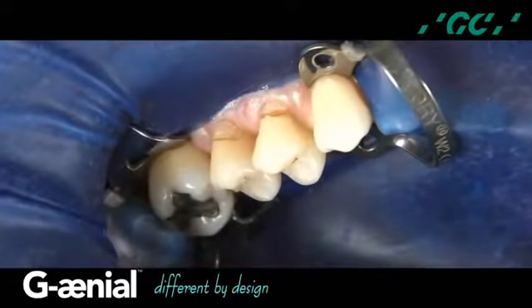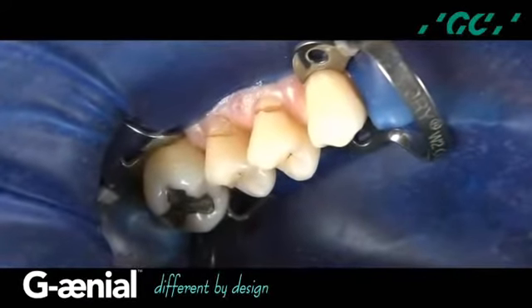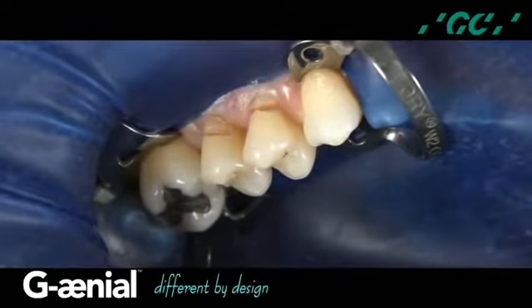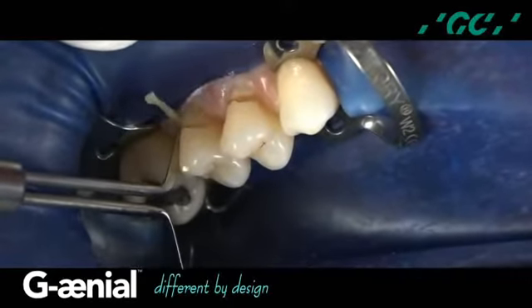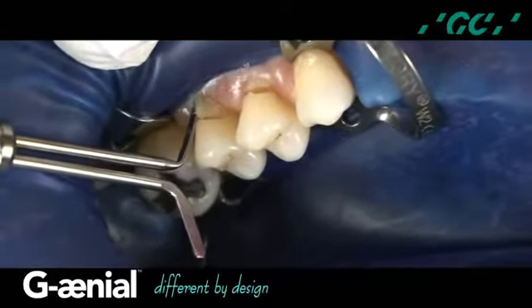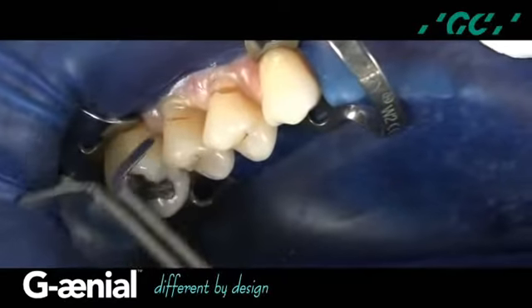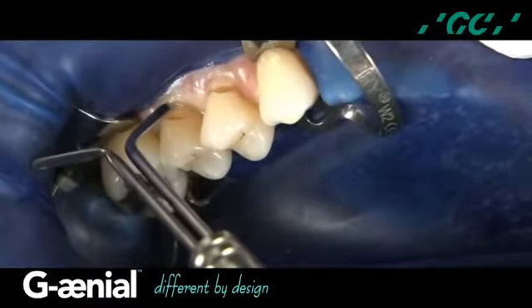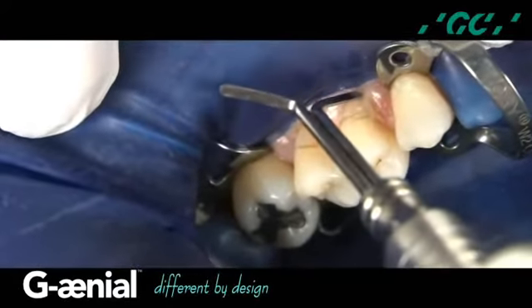After shade selection, the teeth are isolated using Leibenberg's modified dam technique and sealed and secured with a spot of cyanoacrylate. A retraction cord is placed to gain adequate access to the gingival margin and to control crevicular fluid during the adhesive procedure. This double cord packer TN010 instrument by Garrison Dental Solutions is ergonomically designed to facilitate the placement procedure.